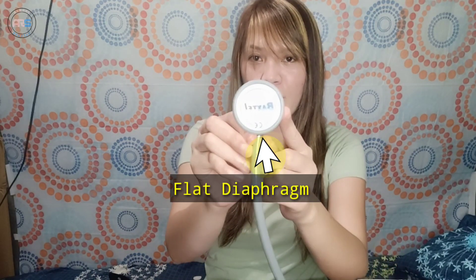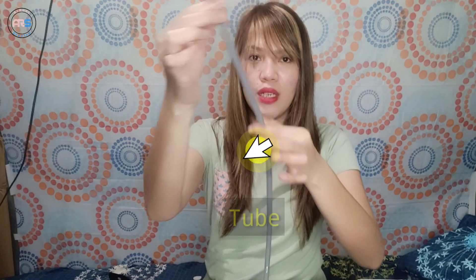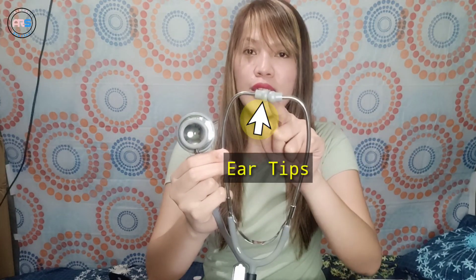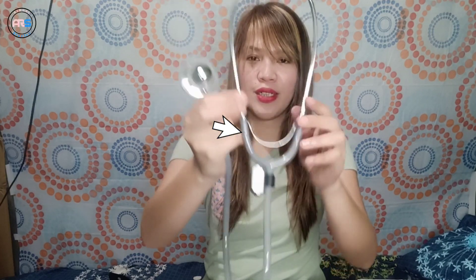So, here is the flat diaphragm, the bell-shaped diaphragm, the tube, this one is the air tube, the ear tips, and this one is the binaural spring. And there is also a name tag here. So that's the parts of the stethoscope.